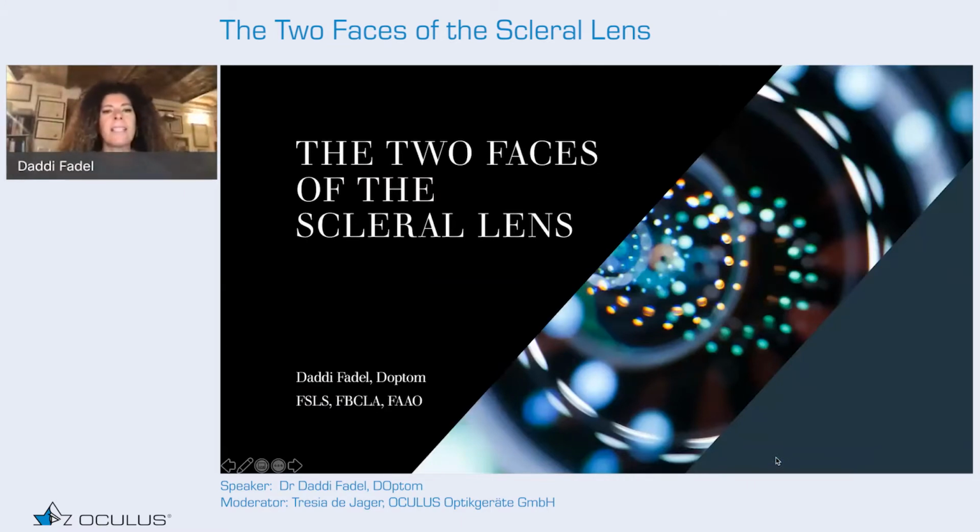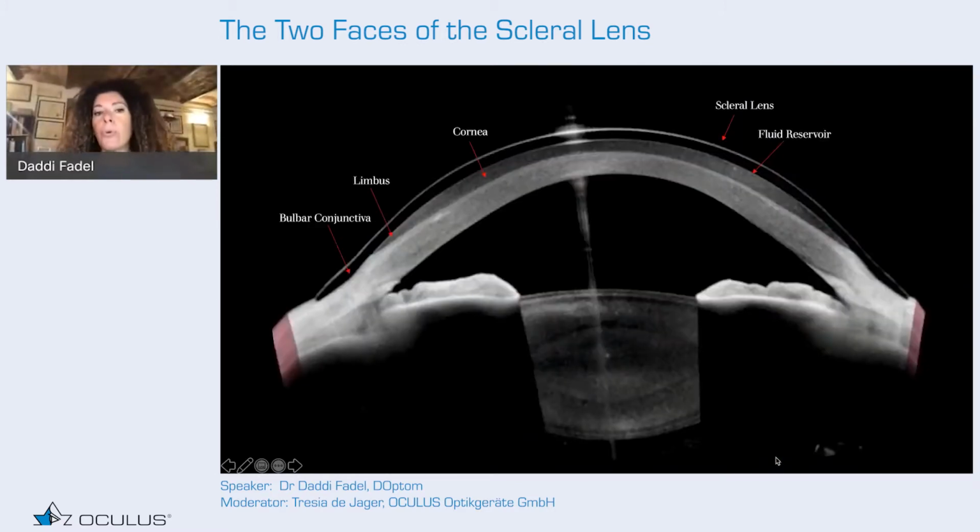While scleral lenses are progressively gaining popularity among practitioners because of the wide range of their indications and benefits, there are still several aspects of these lenses that present challenges. Also, each eye is unique and has a unique surface profile and optics. Often, we definitely need a custom scleral lens. Generic lenses can never be an adequate substitute for a custom specialized lens fabricated for each individual eye. These challenges concern both the posterior and the anterior surfaces.